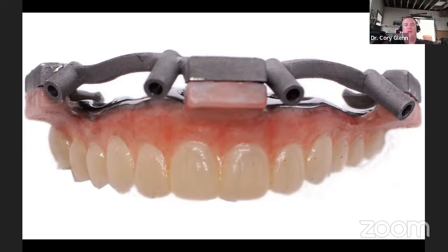The only mode of failure on a restoration like this is that you potentially chip a tooth. Well, big deal. If your temp is PMMA and you break a tooth off, you have to mill a new PMMA. With this, put some bonding agent on it and fix it in the mouth with composite. Even in a worst case scenario, let's say they broke a 4-tooth section off. Okay, well, I'll just bang this thing with a hammer. That'll all fall off, and I just reprint the superstructure.